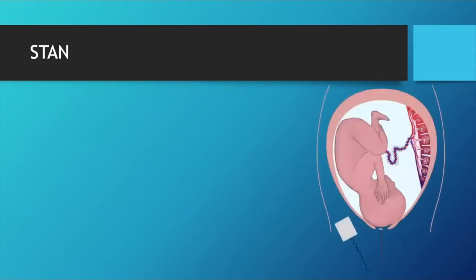Okay. So how do we apply STAN? We know that for STAN, we need to work through an FSE, yes? So a scalp electrode that attaches to baby, that is supposedly picking up baby's heartbeat signal. Can I rely on that to figure out what the baby's ECG looks like? No. Why not? It feels like it won't be 100% accurate. So that's why it's an adjunct, right?